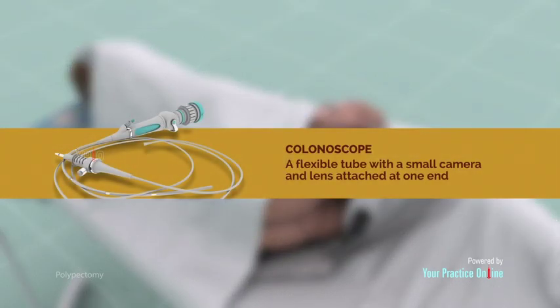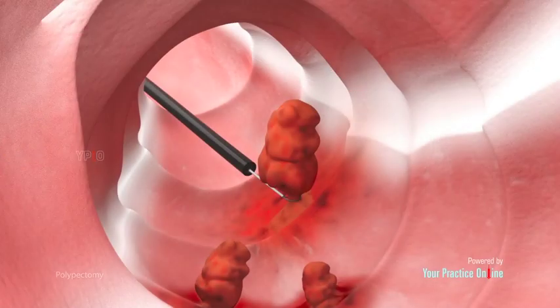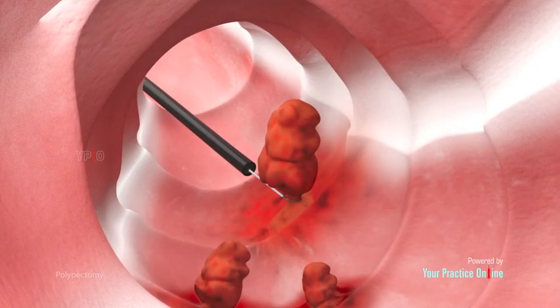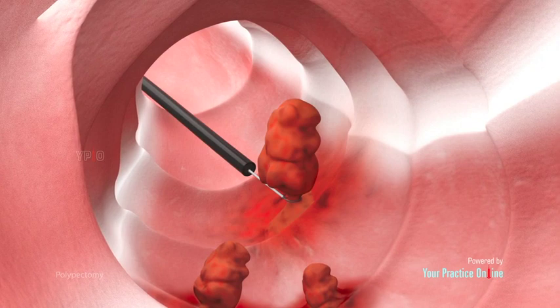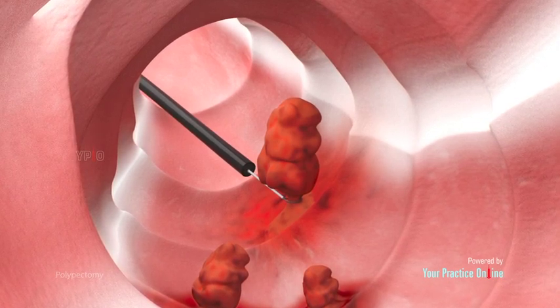a colonoscope, a flexible tube with a small camera and lens attached at one end that is passed through the rectum. The endoscopist may snip off a small polyp with a forceps, or remove a larger polyp with a snare that burns through the base of the polyp using channels in the colonoscope.